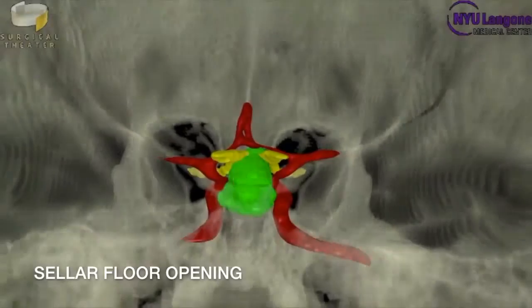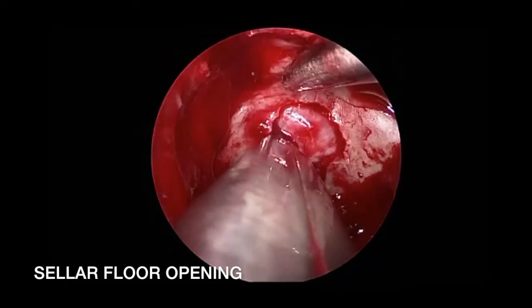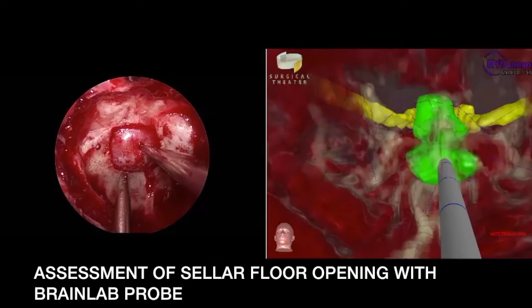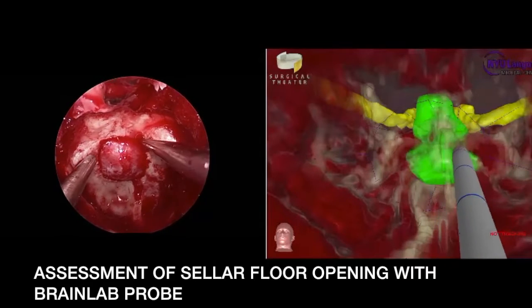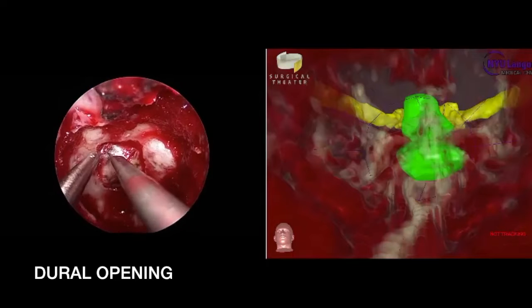He's an ENT surgeon. We are removing the bony floor of the sella, and now we've exposed the dura, checking with the neuronavigation our bearings to ensure that we have adequate exposure. Here we're incising the dura in cruciate fashion.